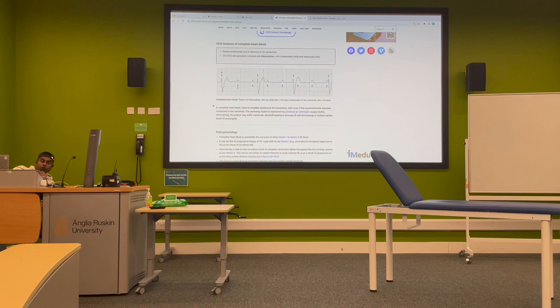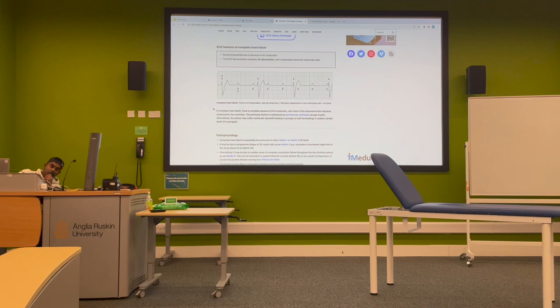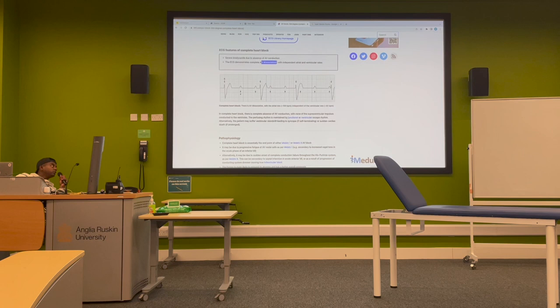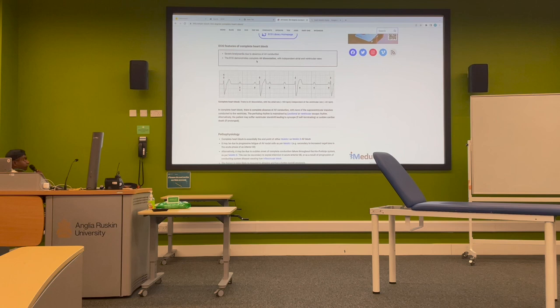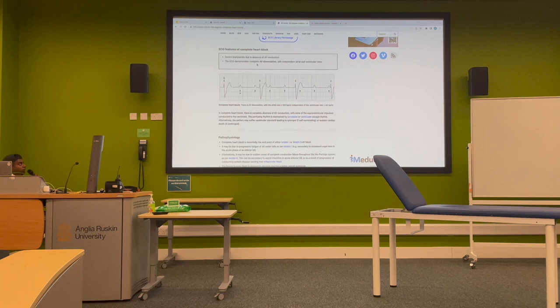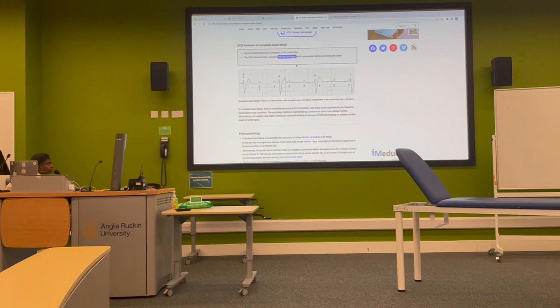What is a ventricular rate? It's the rate at which the ventricles contract, correct? So yeah, just literally make sense of it. Then you'll never have to worry about all these picky little keywords. These keywords will make sense to you. You will think of the keyword. If you're thinking, right, the atria and ventricles have dissociated, what would you call them? You would call it atrioventricular dissociation. Wow!